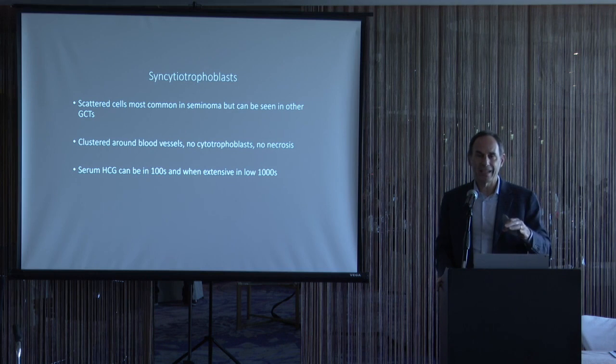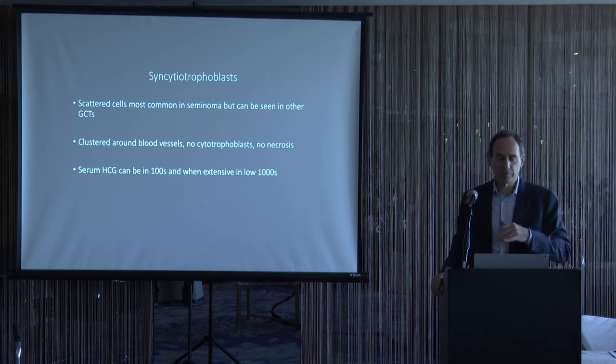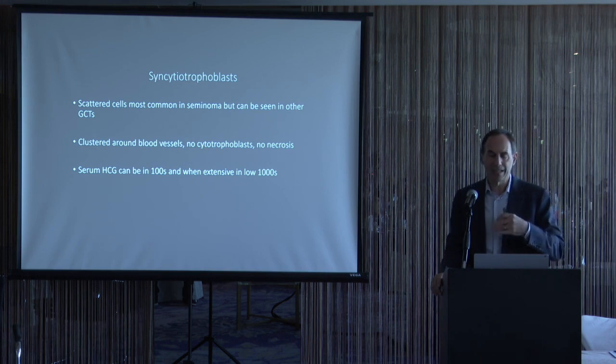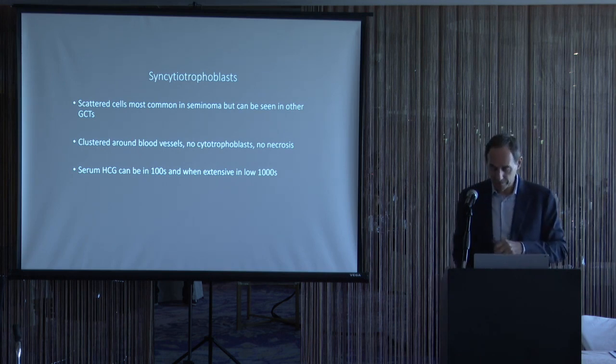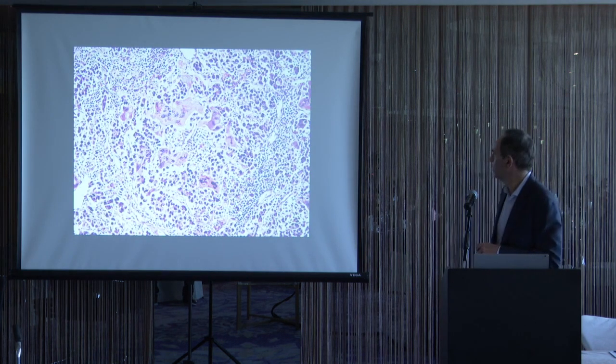Syncytial trophoblasts can elevate the serum HCG in the hundreds, and if you have extensive number of these syncytial trophoblasts, it can even be in the low 1,000s. Choriocarcinoma, typically HCGs will be in the tens of thousands, hundreds of thousands, but it depends on how extensive the choriocarcinoma is. So this is an example of a seminoma with extensive syncytial trophoblasts.